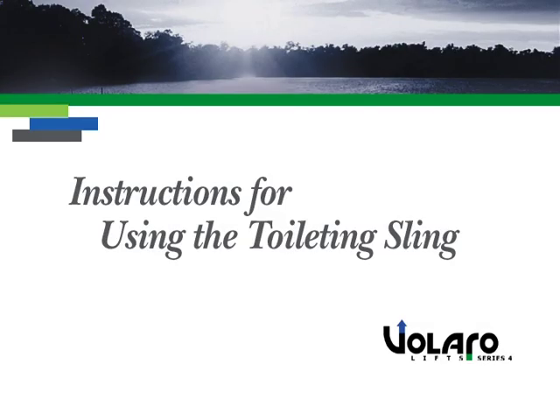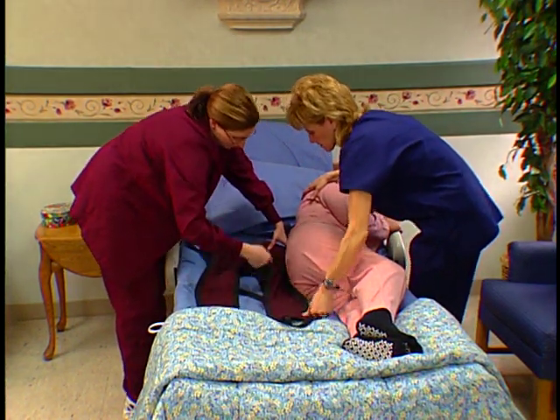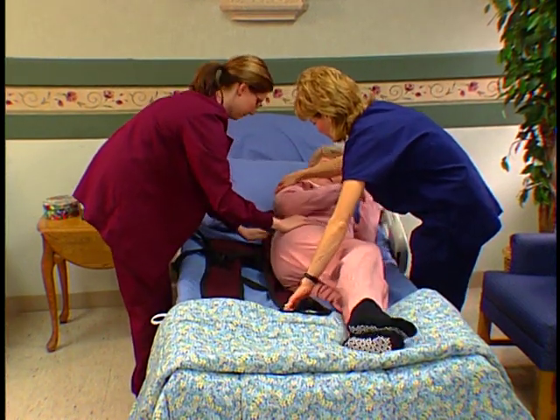Instructions for using the toileting sling. Remember, you'll want to use the toileting sling on patients with enough upper body strength to help in their care, to ensure they do not slip through the sling.